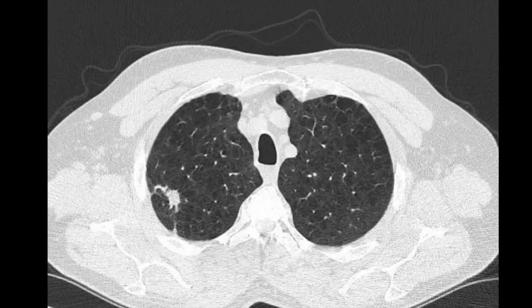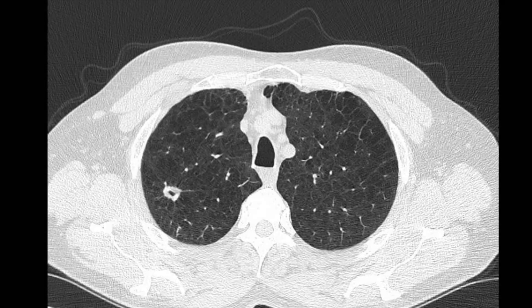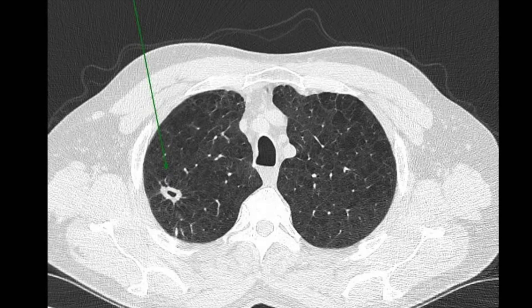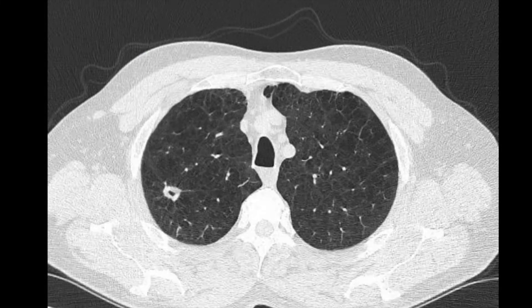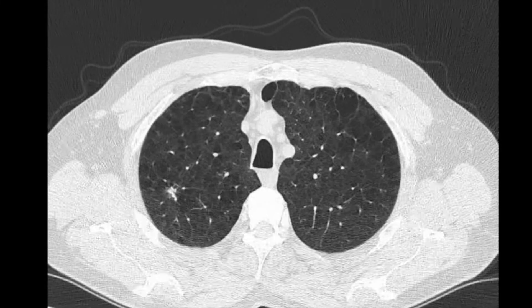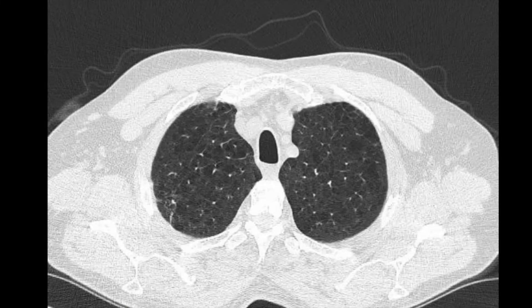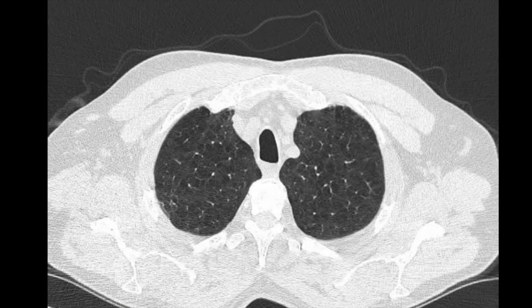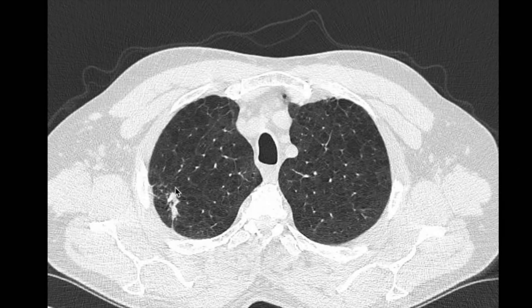As we scroll down we get to the abnormality here in the lung, which in fact is a cavity as pointed out by the radiologist. The cavity measures about 18 millimetres. It has some concerning features with some spiculation around the outside and there's no air fluid level. It's a relatively thick-walled cavity considering the small size of it, but towards the apex there may be some consolidation and nodular change.